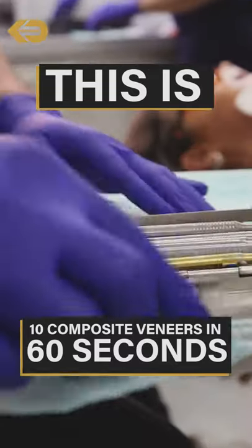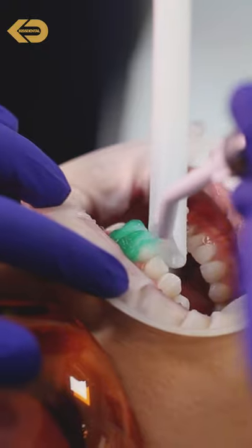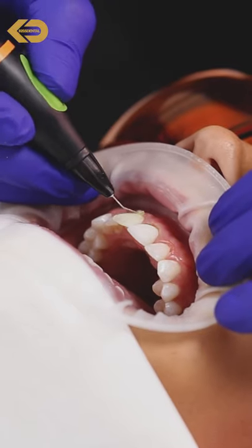This is 10 composite veneers in 60 seconds. First we etch the tooth, which prepares it for bonding.